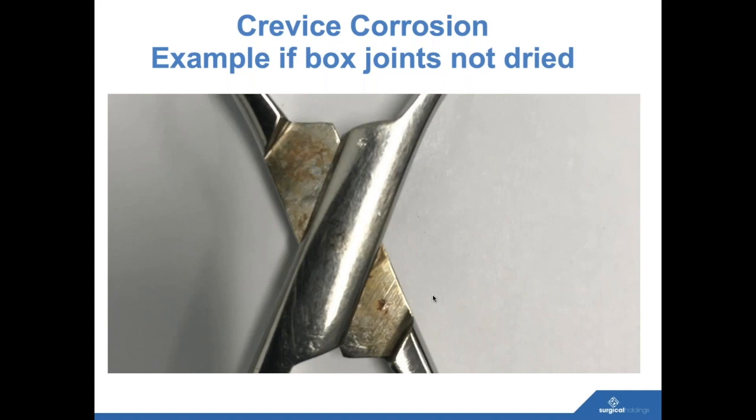Do you think that's because, as we've seen in the UK, some of the more common instruments, like the sponge holders and stitch scissors, are deemed to be the cheaper instruments in the set, and may be overlooked? Sometimes they're not always replaced when they should be, perhaps because they're not playing as key a part in the surgery. Absolutely. Yeah, quality definitely plays into that as well.